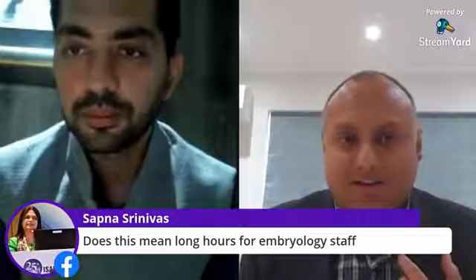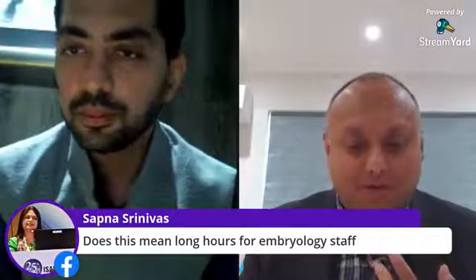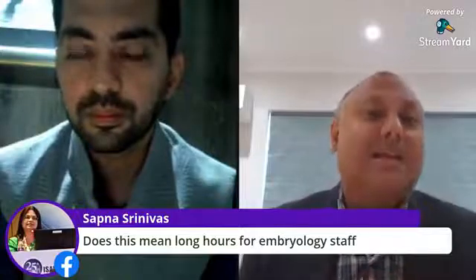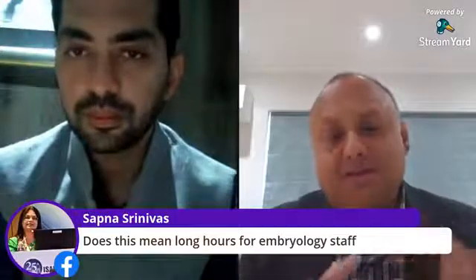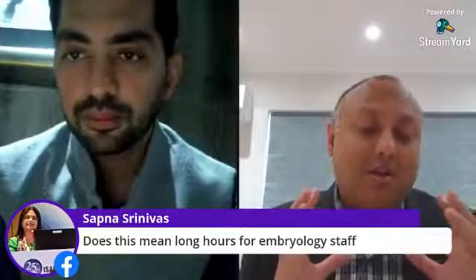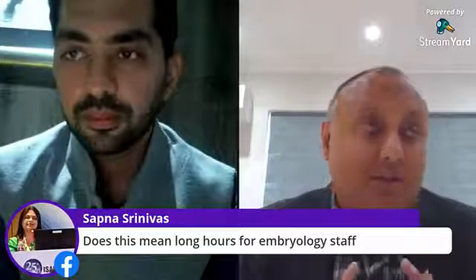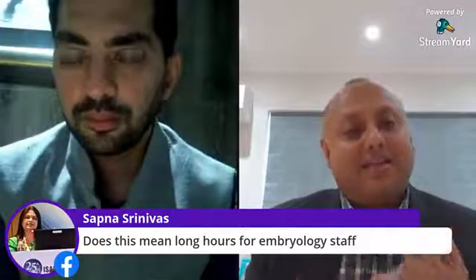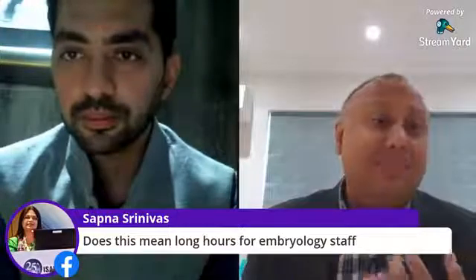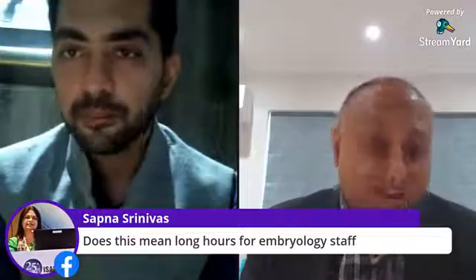We've talked about sterilization, we've talked about validation of equipment. Now you ask me what other specific precautions one takes in the lab. Let me touch a bit on that. For example, egg collections and sperm prep. One thing the HFEA have said is that anything where there are native body fluids, such as follicular fluid and semen, should be diluted down.